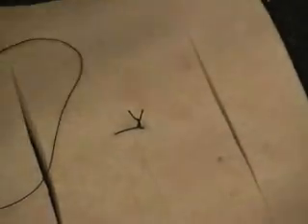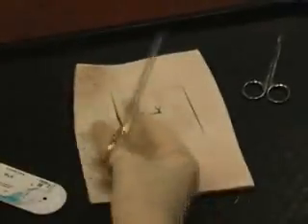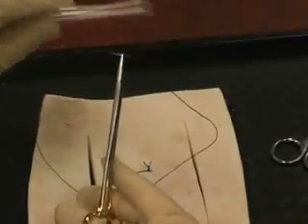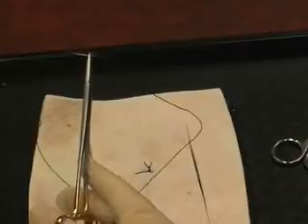And now we're ready to go ahead and place another simple interrupted. So we're going to go ahead and load up again. We're going to get our smiley face where it's pointed to our left shoulder. Come straight down as if we're shaking hands. We're going to grasp it in that same location. We're perpendicular. We are at the tip. Concavity's furthest from us, pointing to the left shoulder.